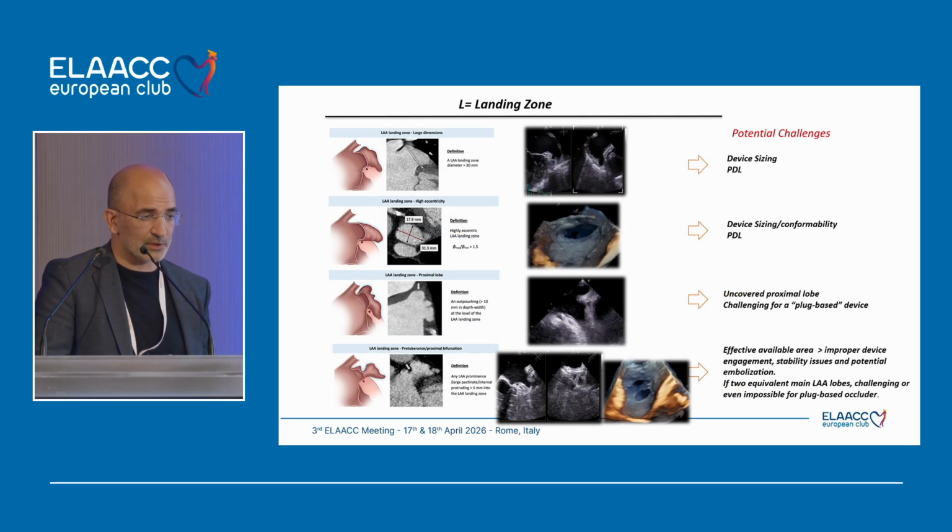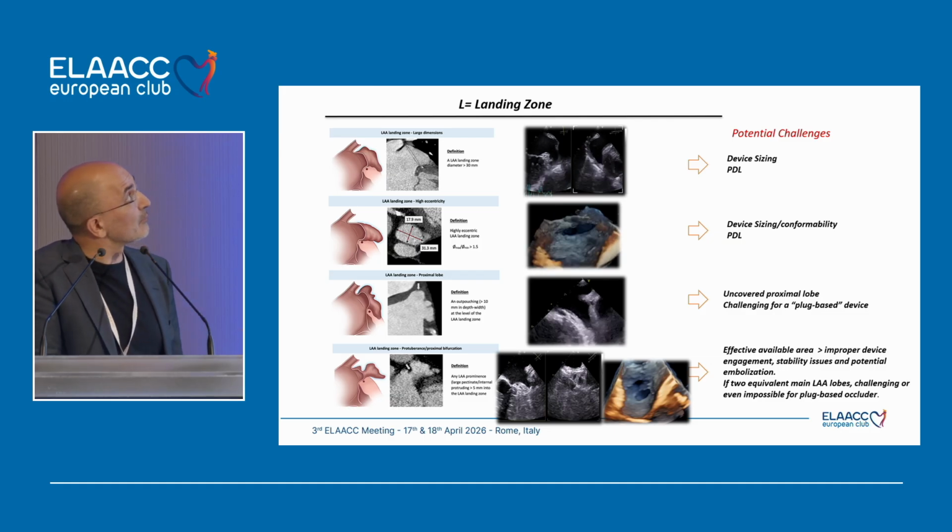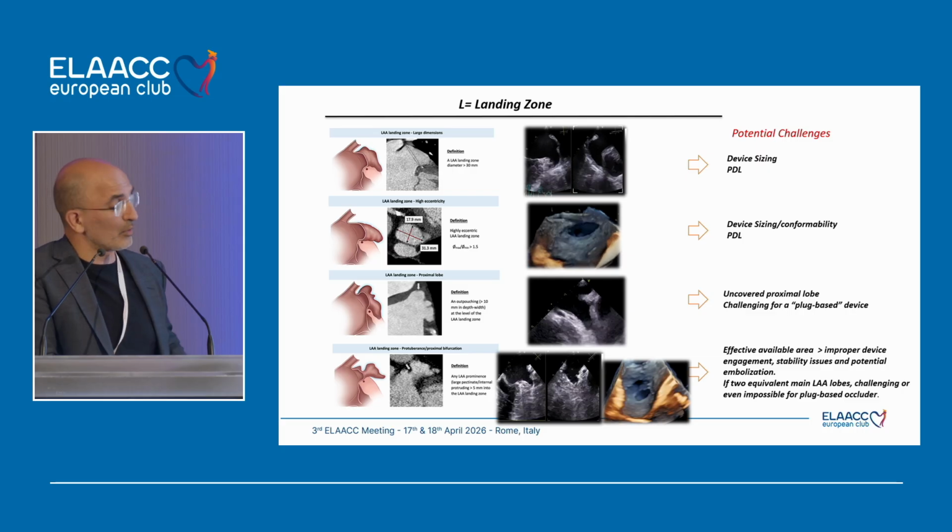And then there was the landing zone. There were 4 parameters. The first was the large dimension of the landing zone, so more than 30 millimeter.